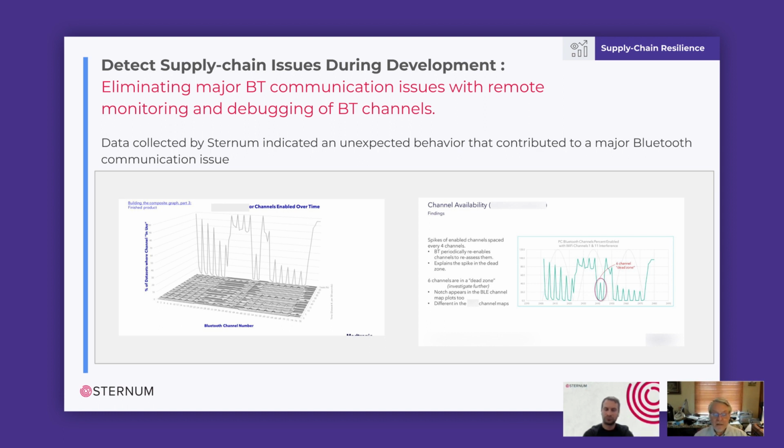So that gives us some basis now for going back to that environment and trying to find out what changed, because apparently something was turned on, as it was a very drastic change in the environment. Maybe some piece of equipment was being used that generated noise in this spectrum. We don't know yet, but at least we could see that it was just a really sharp drop-off, indicating that there was some event that triggered it.